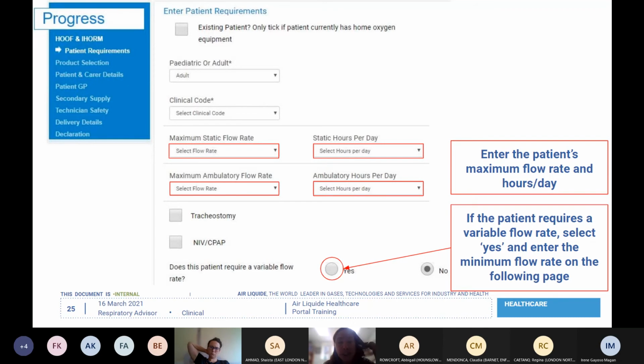for ventilation. So it is important that you understand that mum, dad, parents, guardians have to be trained in connecting the equipment to their external equipment. And we can also not guarantee that it's going to work, okay?